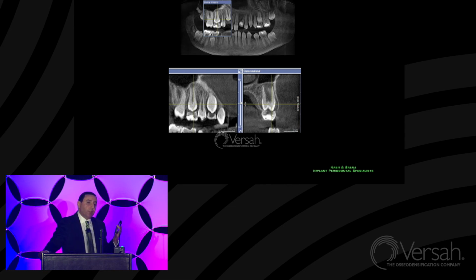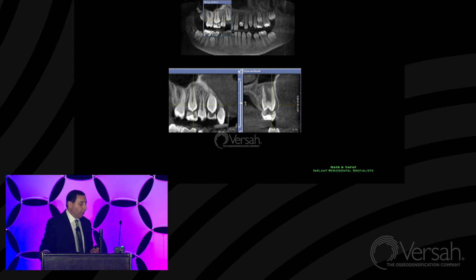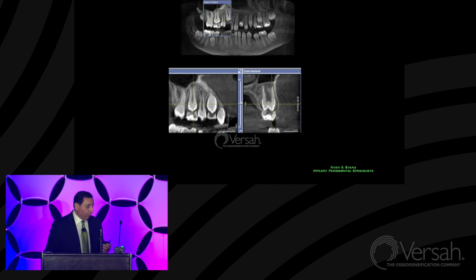So I decided to transplant the maxillary right premolar rather than a mandibular premolar or maxillary left because of the anatomy of where those other teeth were and the complications with possible surgical extraction of that tooth, making sure that I keep that intact follicle to preserve the Hertwig's epithelial root sheath so the tooth would grow naturally. So we're going back to our biology on this. So here's the donor site, here's the recipient site.